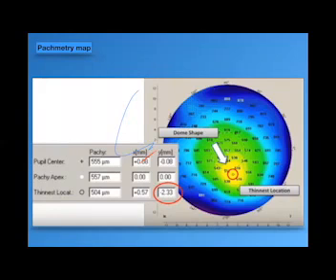Also, the color code and color scale of this pachymetry map is dome shaped. This dome-shaped pachymetry map is a suspicious figure. Before studying the numbers, you may suspect this patient from this shape first.